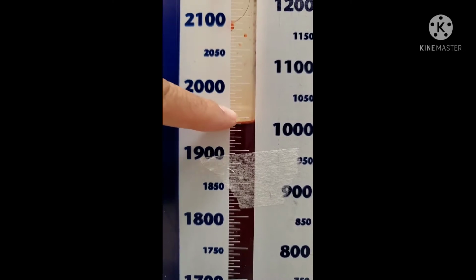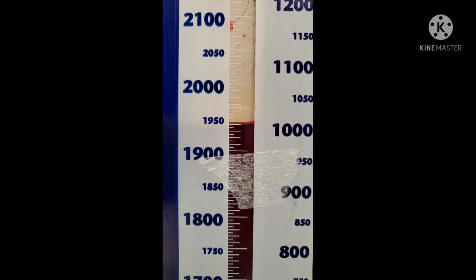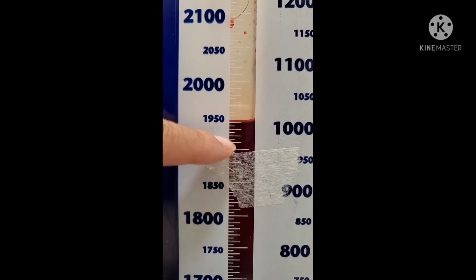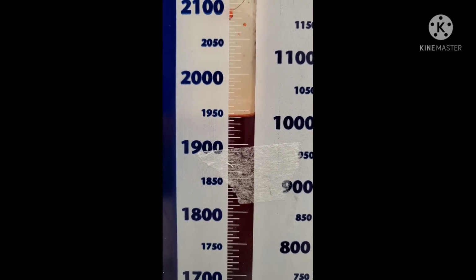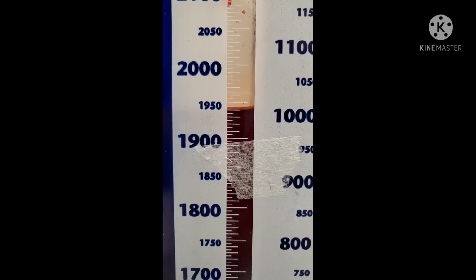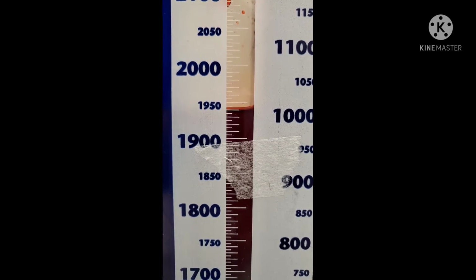All right, well, if this is 1950, it's not quite there yet. I would say it's about 1945, because each one of these little dashes is 5. So my patient has drained 1,945 cc's of blood.